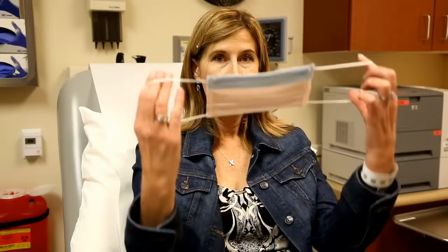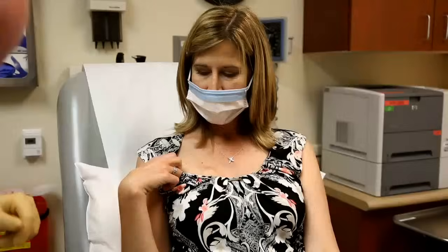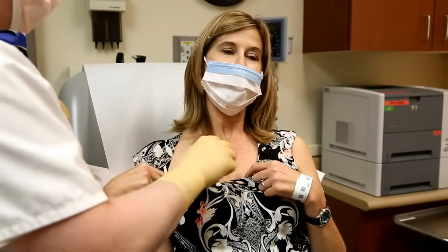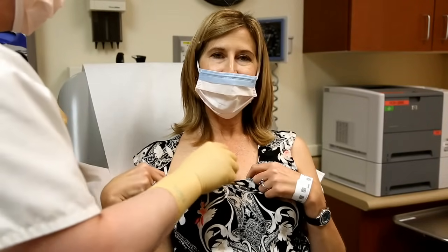Step one: make sure that you're not going to cause yourself any infections — you get to wear this pretty mask. Get you cleaned up here and sterilized. It's a little cold but it's nothing.